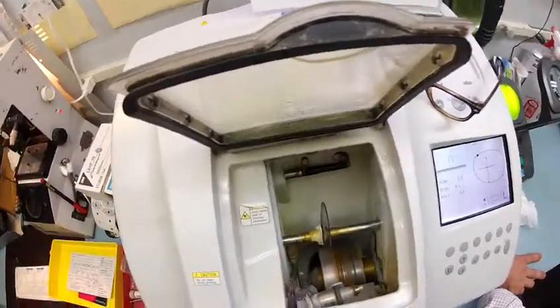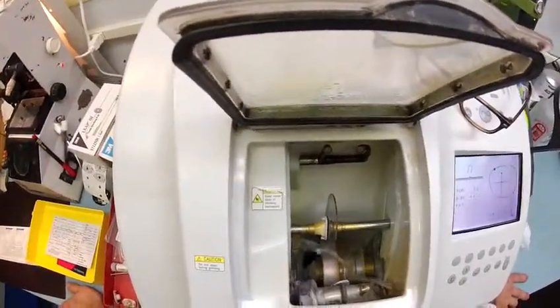So as this begins to cut, I will close the door and continue to work on the right lens.